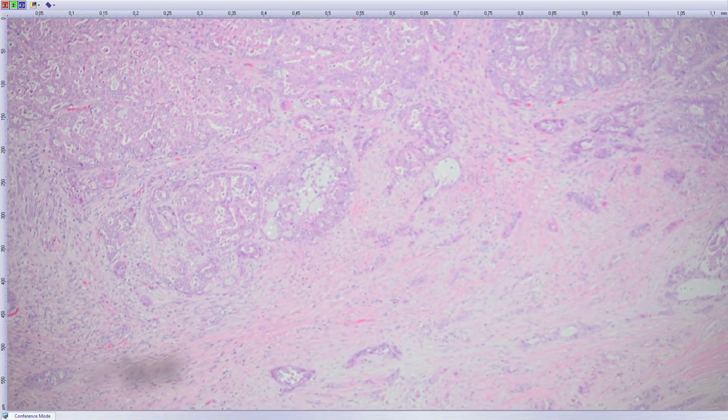carcinoma, which is an identical tumor to those in other locations, especially the salivary gland, and we described several cases in skin as well. And we have even one case that occurred within the mammary-like glands of the vulva. So they can appear even in the vulva, arising from mammary-type glands.